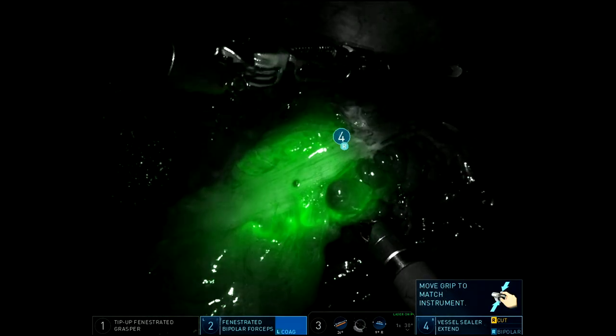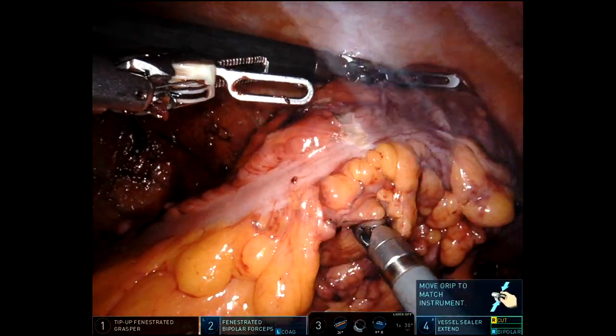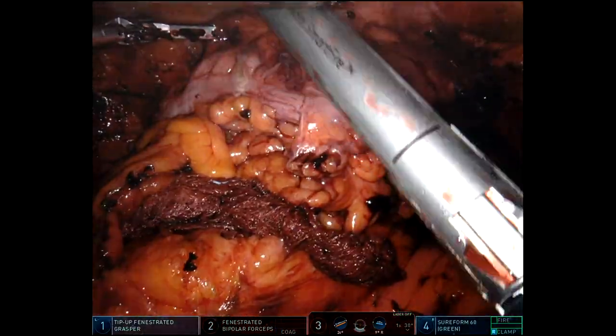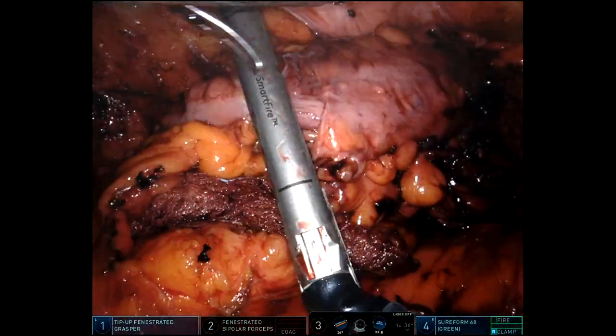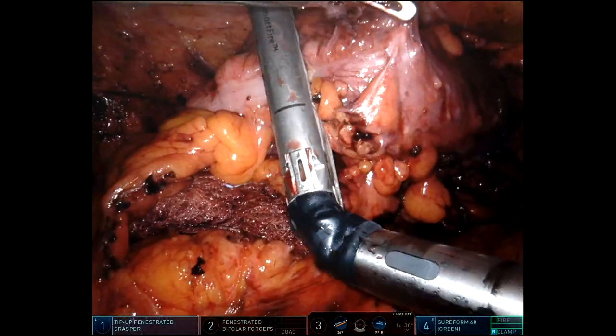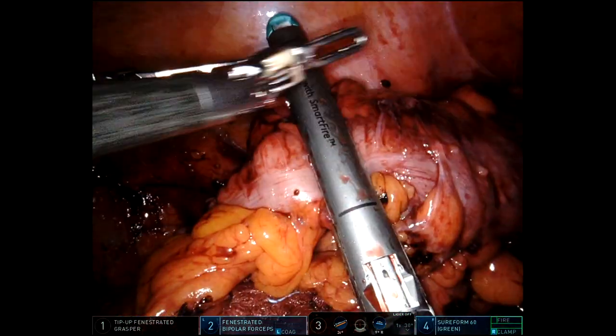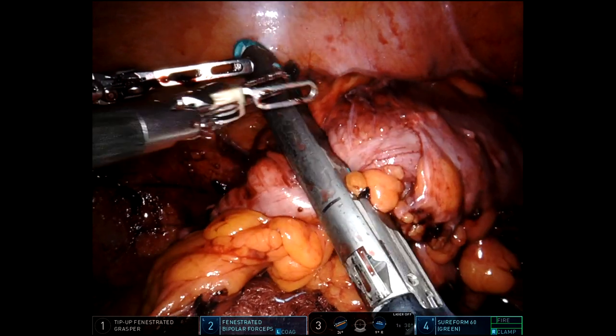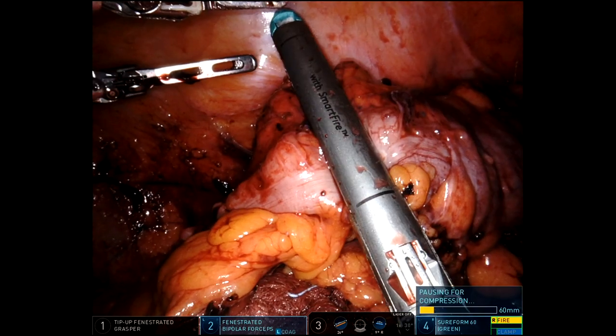Always check perfusion. I make a mark with the cautery so that I know where to divide once the ICG has washed out, and I'm going to go ahead and do that now.